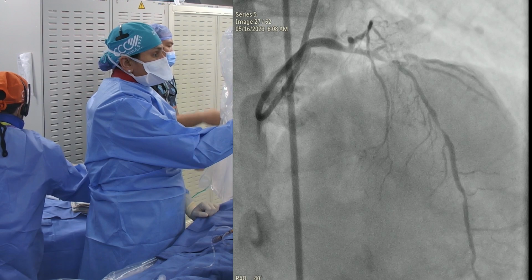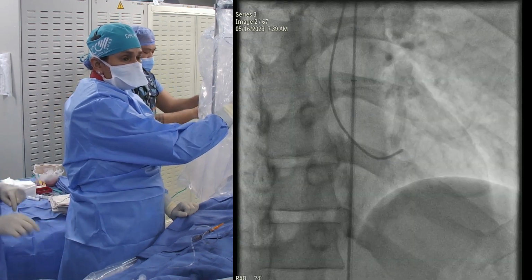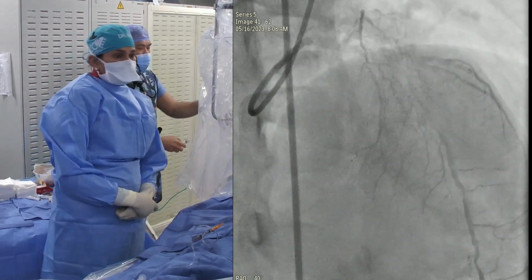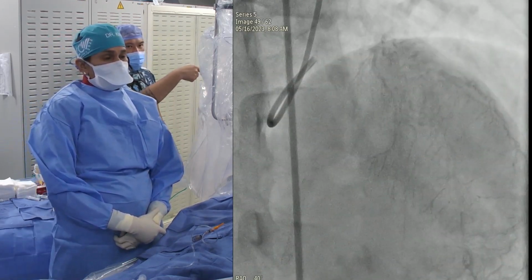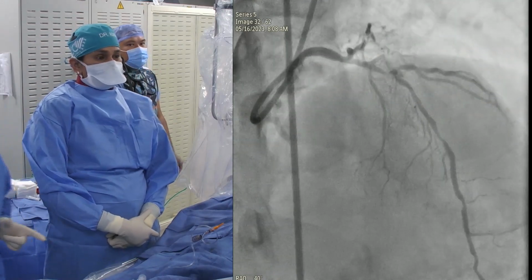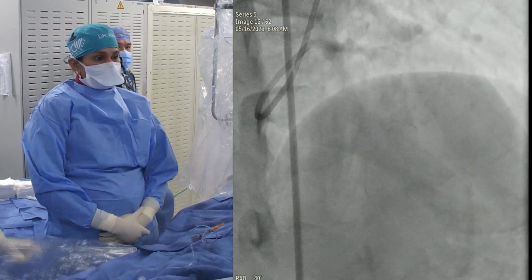We can see the angiogram. Yes, so very complex plaque. We have EF normal, then we have the RCA, the PCI site. The stent looks good. This is where we are with the LAD. After the significant proximal mid disease, you have a small pouch ulcer. There's a D1 that's occluded and D2 that's coming out through that pouch. And the majority of the calcium is just at that bifurcation, mostly in the main vessel.